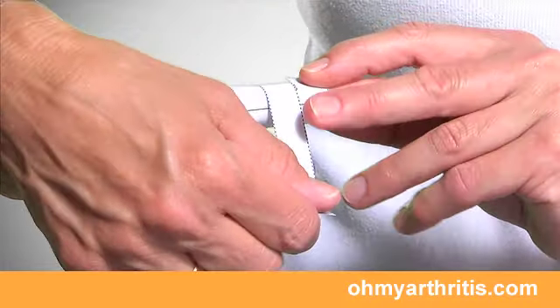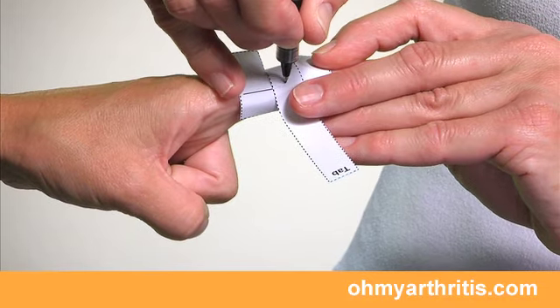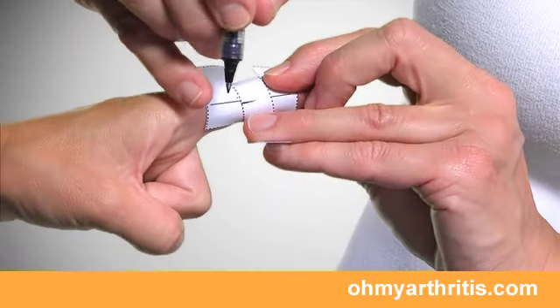Pulling lightly on the tab, mark or have your helper mark the tab where it overlaps the measurement line. Then pull the tab a bit tighter and make a second mark where the tab overlaps the line.